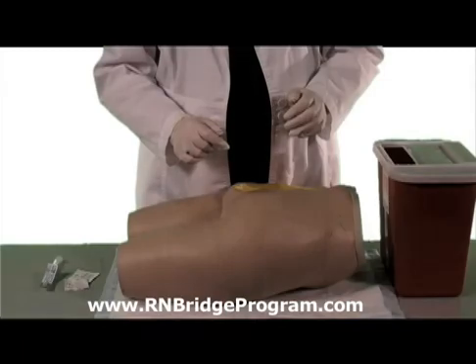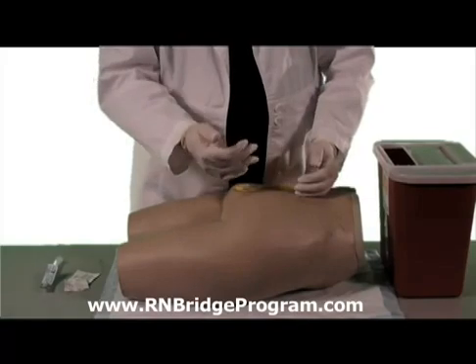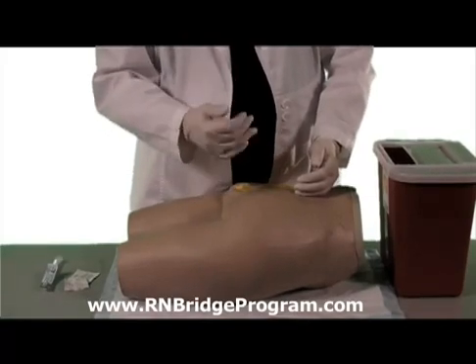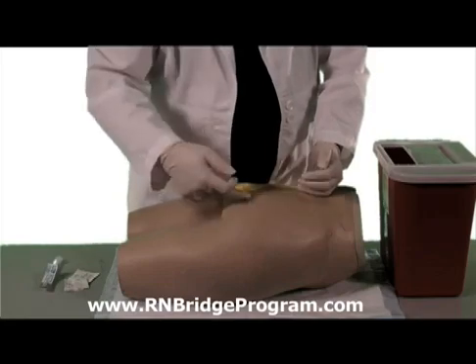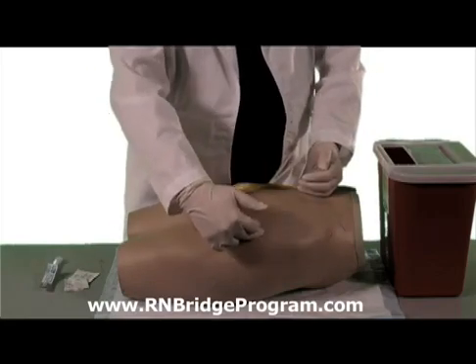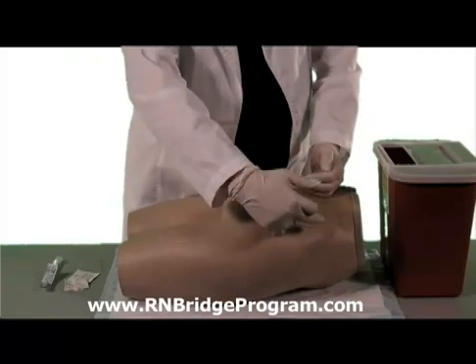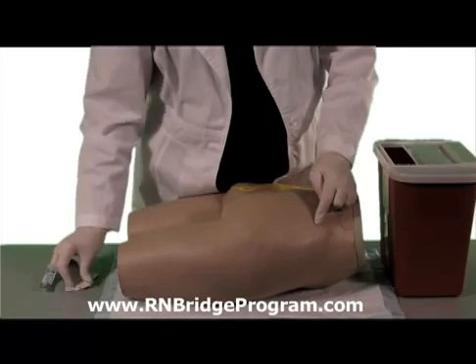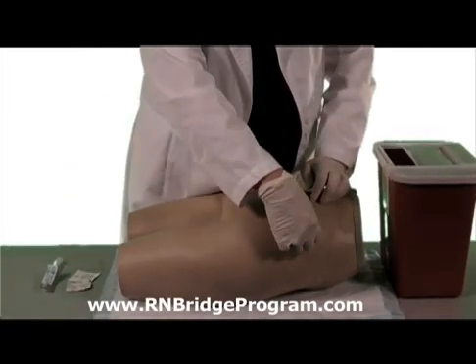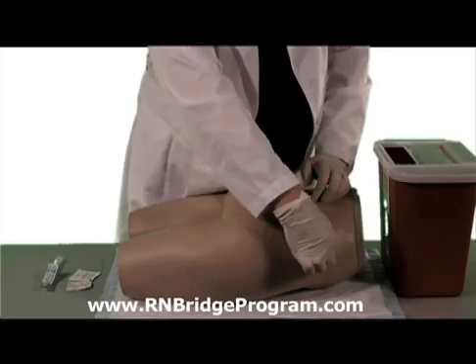Now let's go down to our patient. Here we are back at the patient. We're going to go into the gluteus maximus muscle. Draw your landmarks again, both vertically and horizontally, making a crisscross pattern on the muscle itself. Remember, we're going into the upper outer quadrant. Once you find your landmark, take your alcohol, put it on the site where your landmark is, and draw a circle from the inside out.